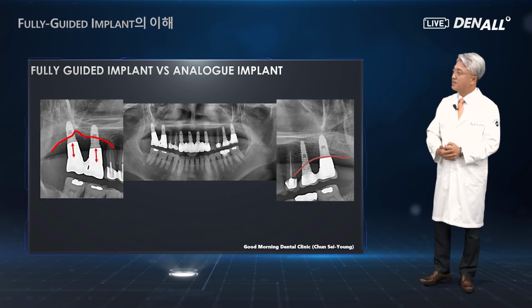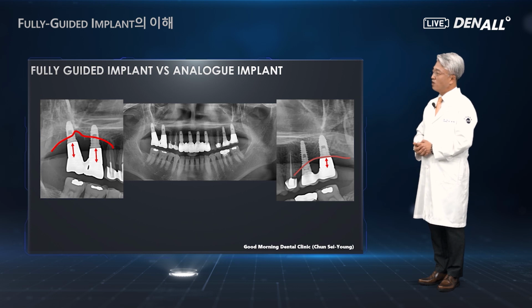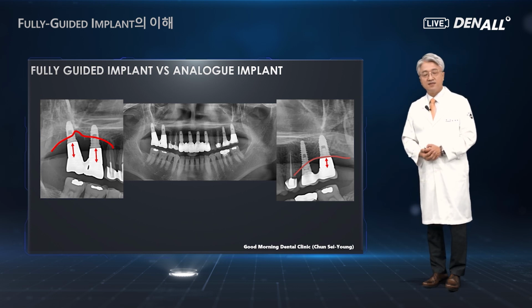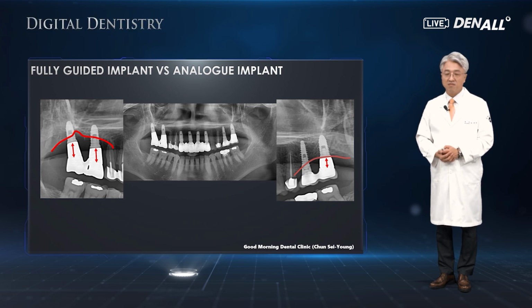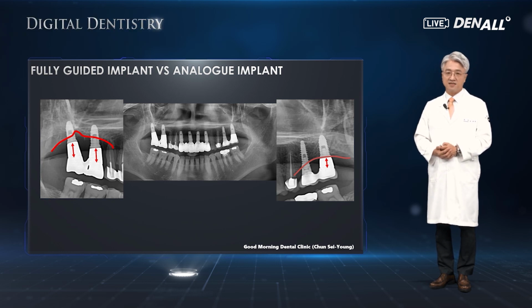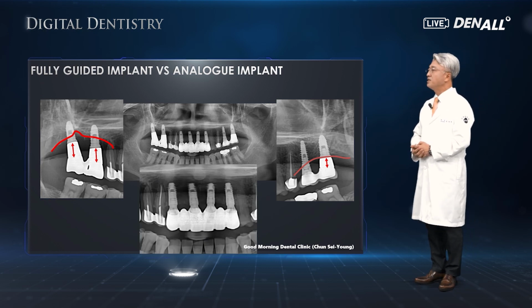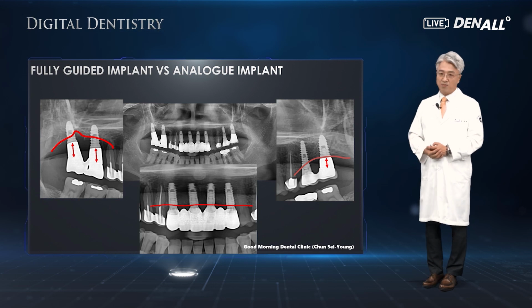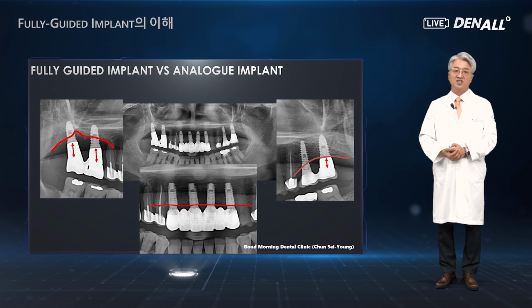On the opposing side, the implants were placed in the same dental office. Number 7, the abutment is very long. Therefore, this is a case where peri-implantitis was bound to happen. That's what I thought. So, for the anterior region implants, I try to make the bone level as much in line with the adjacent teeth with the bone grafting.